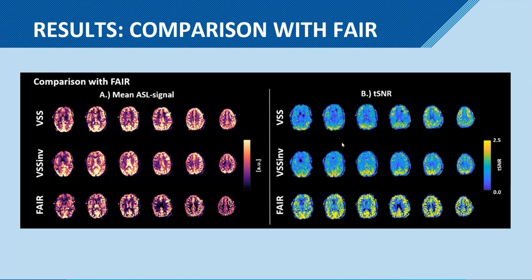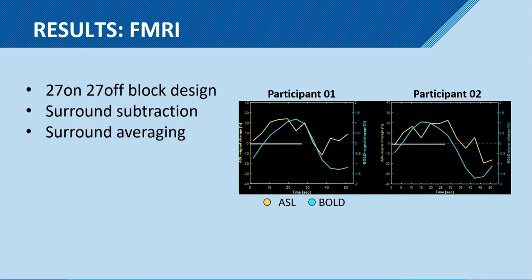We also see here that in the velocity selective ASL, we especially have good TSNR in the posterior of the brain. That's mainly because of B1, because I used metamaterials around the head to homogenize B1 a little bit. But I could clearly see that B1 was best in the posterior lobes at the moment. So the use of PTX, which we didn't use in this project, could be of great help to improve B1 and thereby improving also TSNR for the velocity selective ASL. As I said, I want to apply it in fMRI.